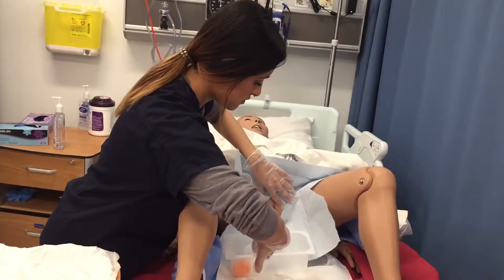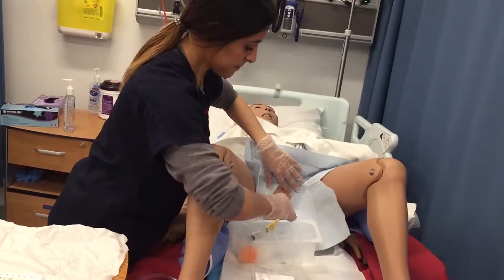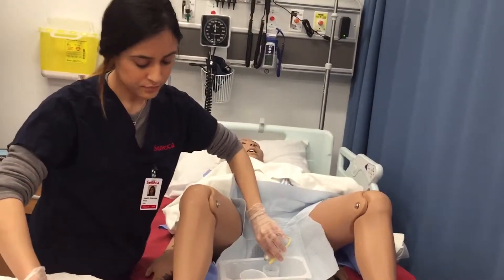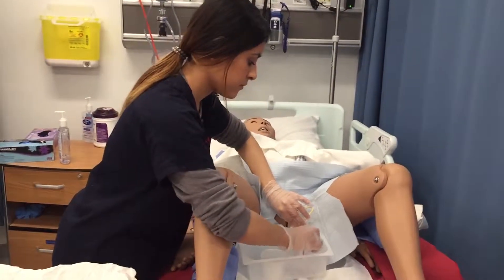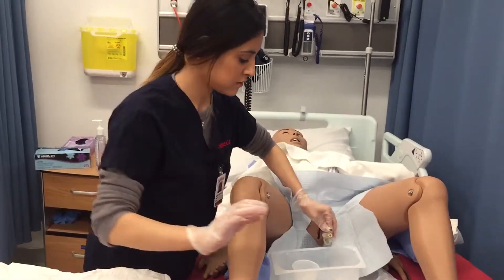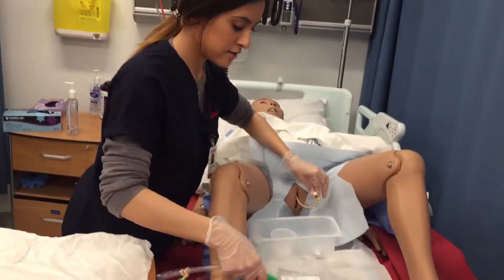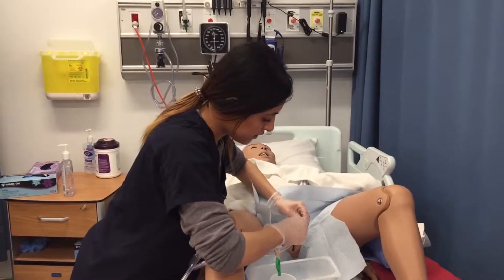I'm going to pump up the balloon. Now that's done, I'm going to take one hand and release the syringe and let the urine flow through. I've collected the urine sample — this is going to go into the lab for later, I'll be sending that down. Using the other hand, making sure it's secure, I'm going to take that off and attach the drainage bag, then wiggle the tubing onto the catheter.